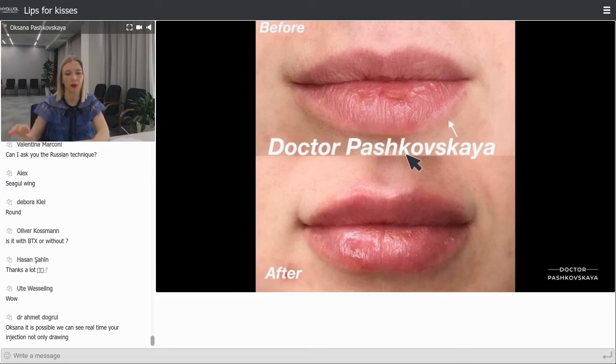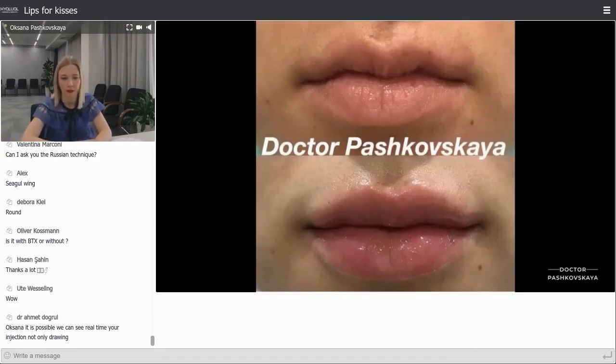I prefer using a very mild, very safe filler to get a natural and good result, and it would not pay attention to her chronic disease.